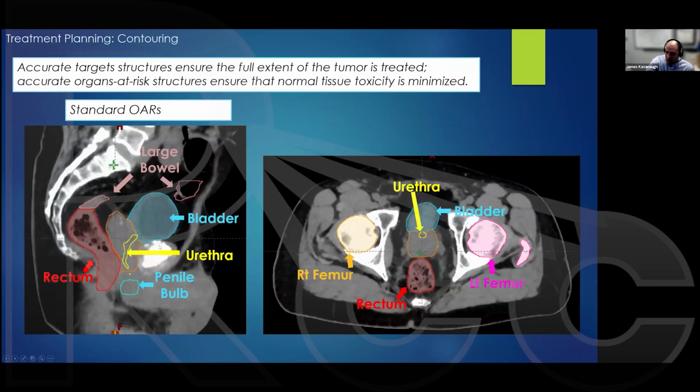So on the MR, contour the urethra, and then we will expand 2 millimeters in all directions. That gives us a PRV, it gives us some ability to say, hey, in this region of the prostate, let's just not allow hot spots here. And so when it does move around day to day during treatment, or if the prostate swelled a little bit during treatment.